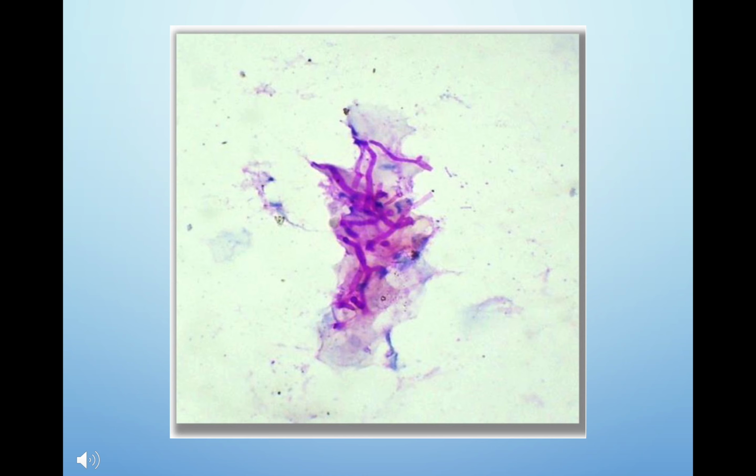And this is what we will see under the microscope when there is fungal infection. The purplish strands are fungal hyphae, while the pinkish material at the background are the epithelial cells and cellular debris.